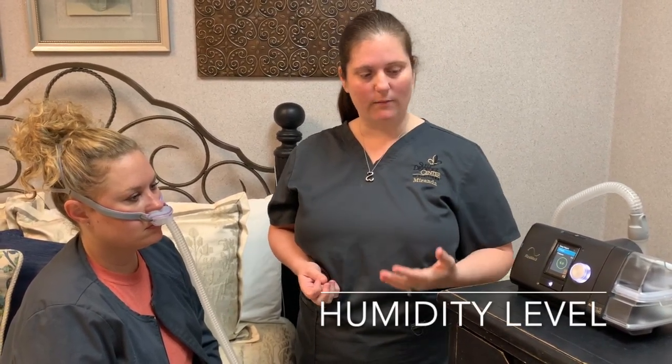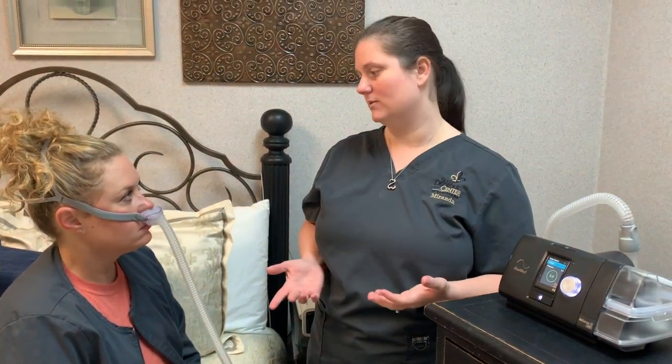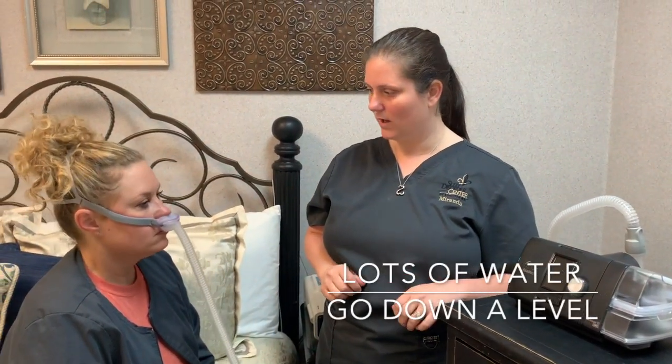This three right here is your humidity level. I start everybody out at three — you just kind of have to find what works for you, since everybody's home is different. If your sinuses are drying out you may want to go up a little bit; if you're having lots of water in your tubing you may want to go back down.